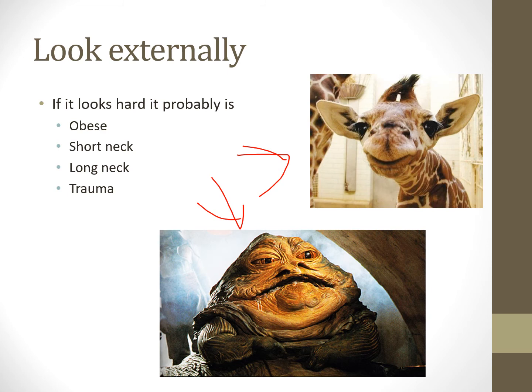Also, if they're obese, that means there's a lot more pressure occluding the airway, or it makes it harder to push the soft tissue out of the way to look at the airway. So we need to be aware we might need to do video intubation with someone that is obese or has a really long neck. Short neck.